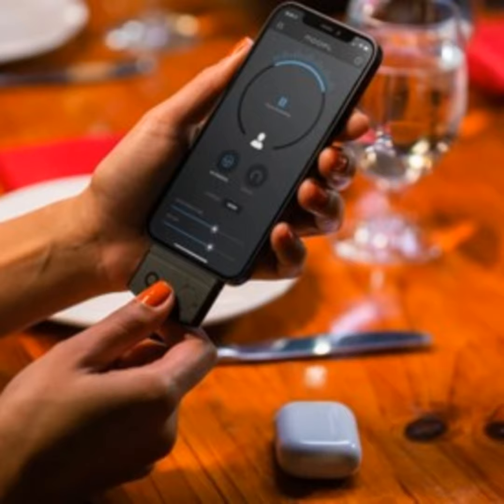So as I move my head right, you can see the blue focus indicator saying now the microphones are actually pointing in that direction. And if I swing my head to the left, you see the focus changes to the left. And it's designed for you to put your iPhone down with the Noopl and not be holding it, obviously.